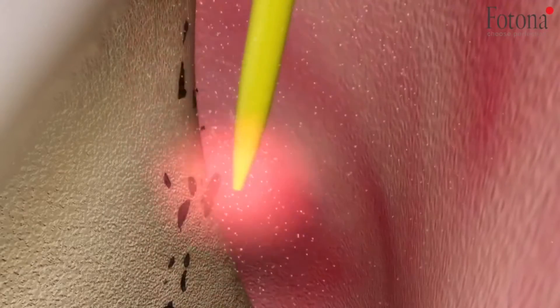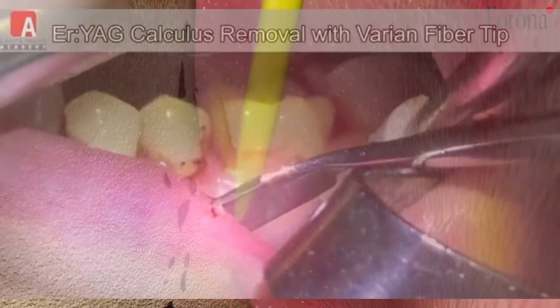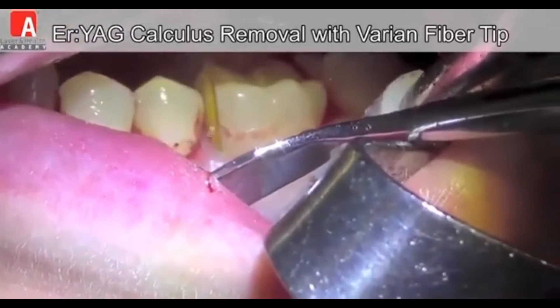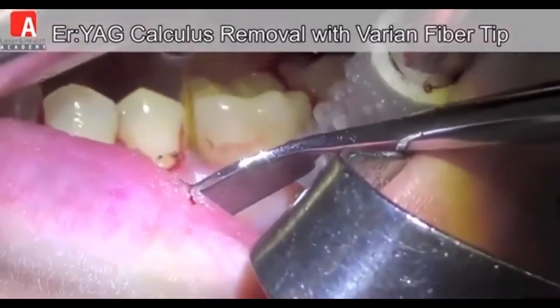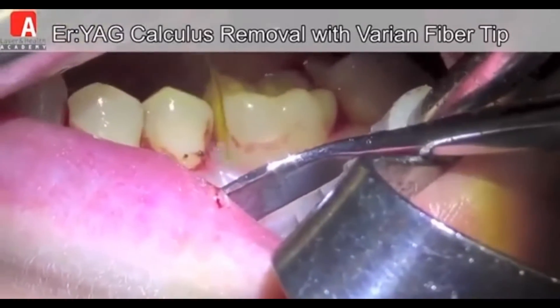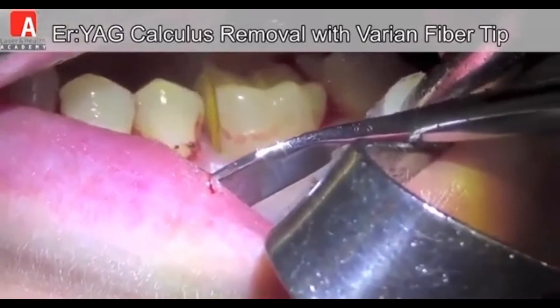As these are taken away and destroyed, the root is also being disinfected by the laser. You can see here a real-life video of calculus removal.